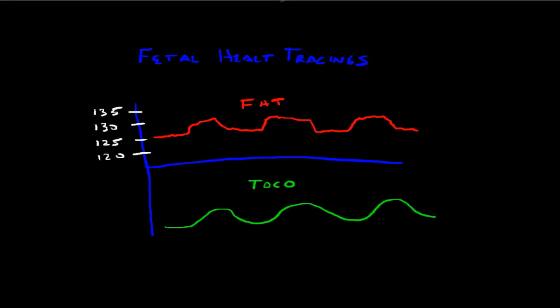Really there's a push for all of us, students, nurses, faculty, to use the same type of terminology. And that's what I'd like to go over with you over the next few minutes here. When you look at a fetal heart rate tracing, there's really going to be two components.